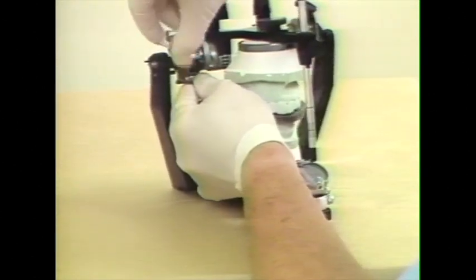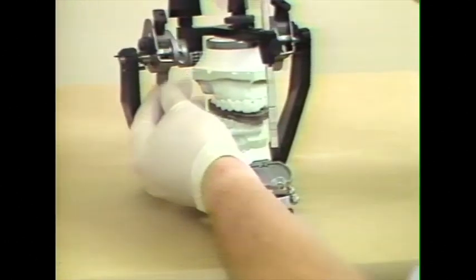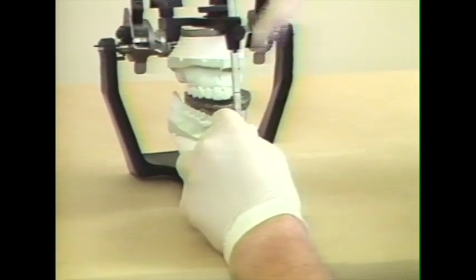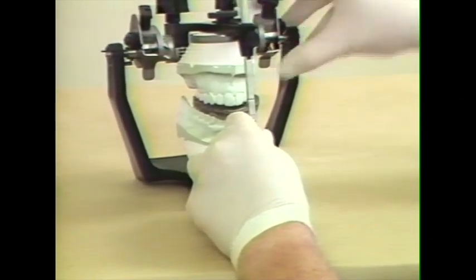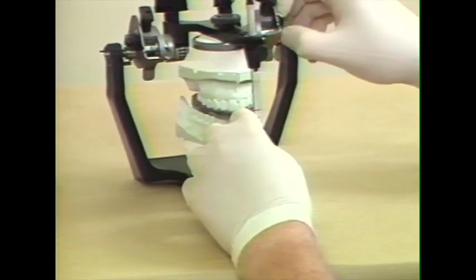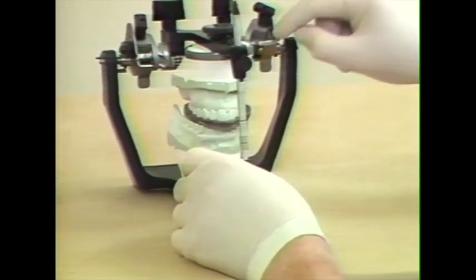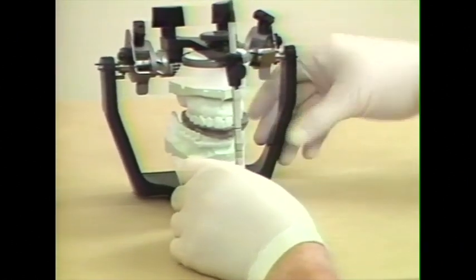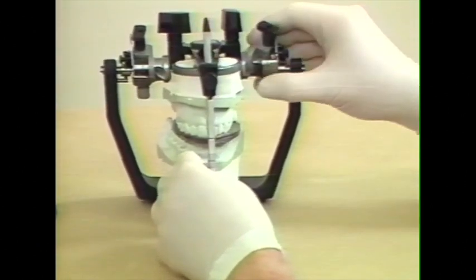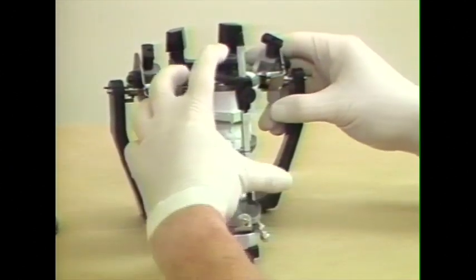And I'll just set them part way up so that we can see the inclination here. And we move the articulator until it will accept the record. I've moved the Bennett angle to the greatest Bennett angle at this point. And we've unlocked the condylar elements. Lock the condylar elements.